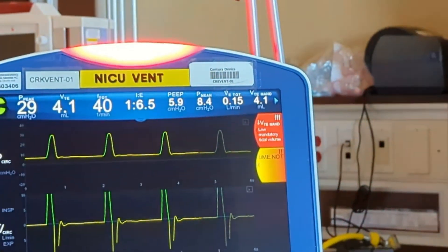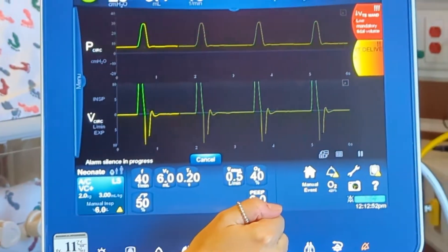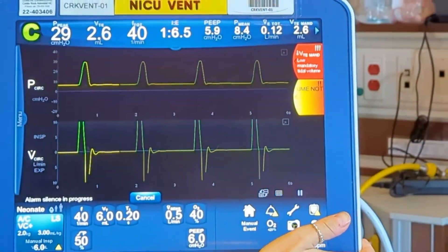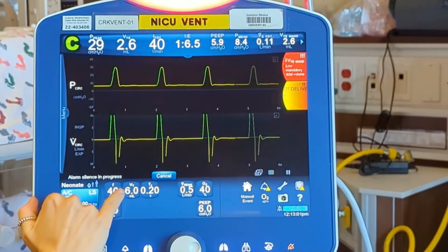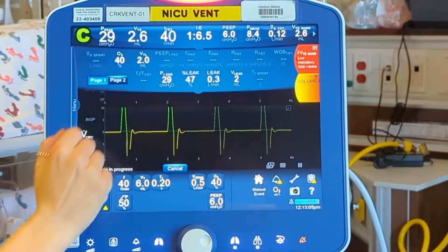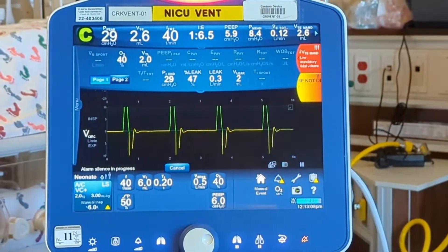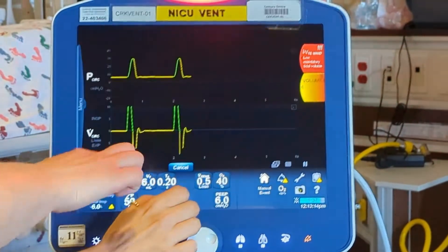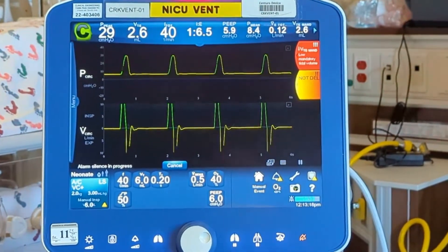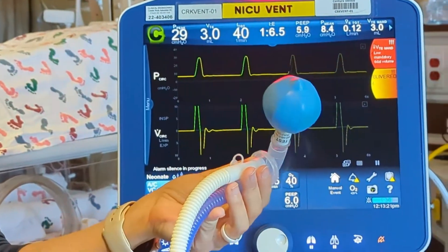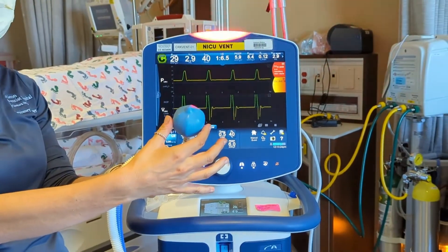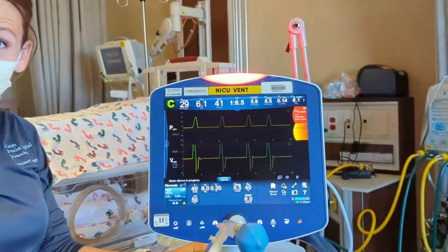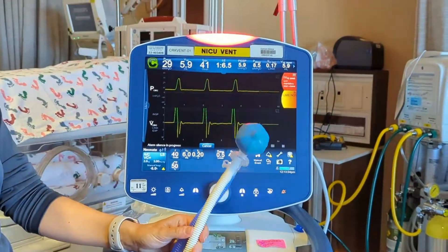We have our I:E ratio — inhalation to exhalation. The PEEP of what the patient's doing. Airway pressure. And tidal volume based on what's set versus what the patient is actually doing. If we press this, we can see what is exhaled. It's a bit hard in this scenario because we have the tidal volume set to be delivered at 6 mL/kg, but we're receiving less than half of that — because this is a non-compliant, likely surfactant-deficient lung.